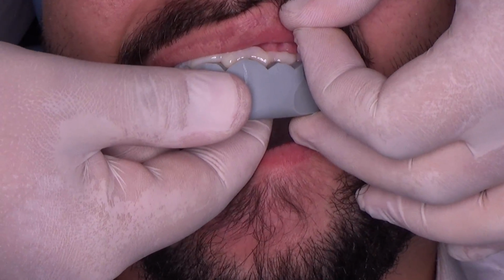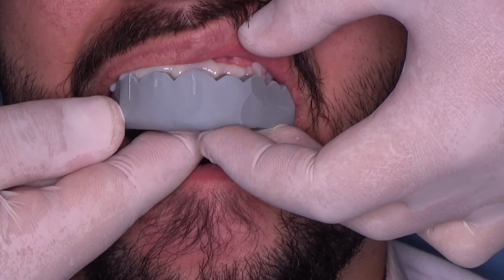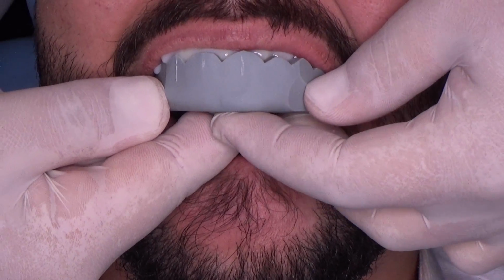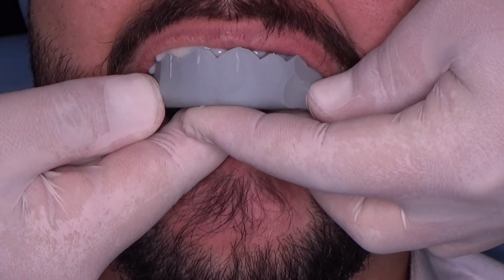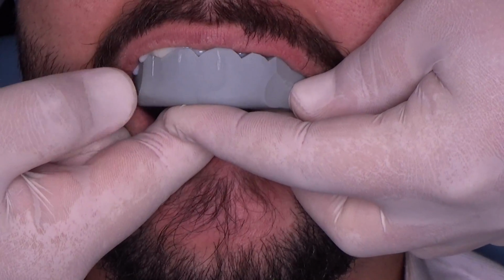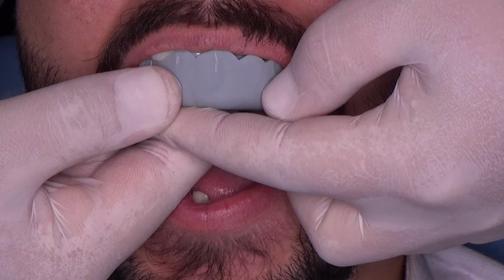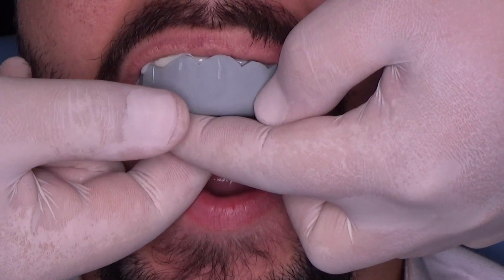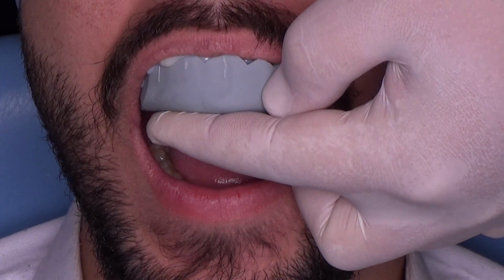Okay, great. You press from the palatal to the vestibular to be sure that the axis is out of his mouth, you see? So you keep in perfect position the key. We wait approximately a minute and a half, and the bisacrylic will start getting elastic. In this stage, we will remove it with an explorer.